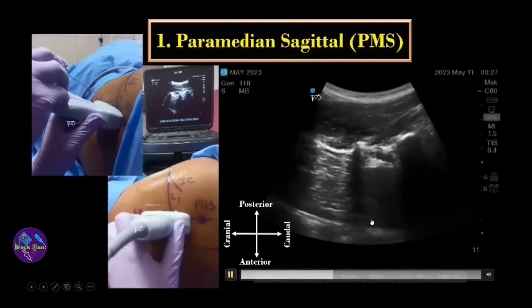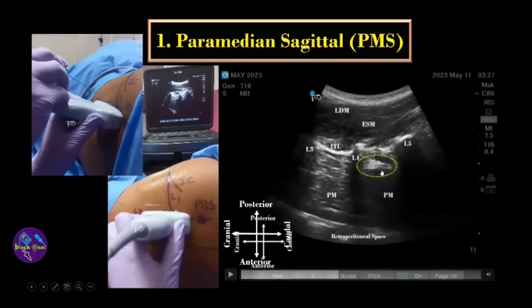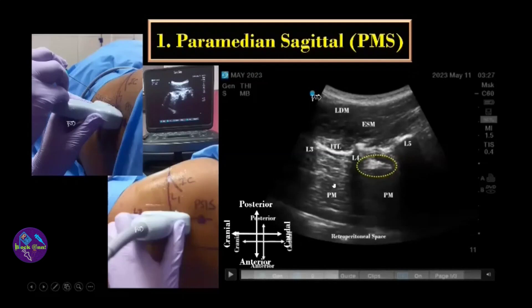If you look carefully, this particular element is thicker, bigger, and brighter compared to the intramuscular transverse striations. These longitudinal striations are characteristic of the psoas major muscle — hyperechoic striations against a hypoechoic muscle background. To identify the lumbar plexus element, note that it is bigger, brighter, and situated at the junction of the anterior two-thirds and the posterior one-third of the psoas major muscle.